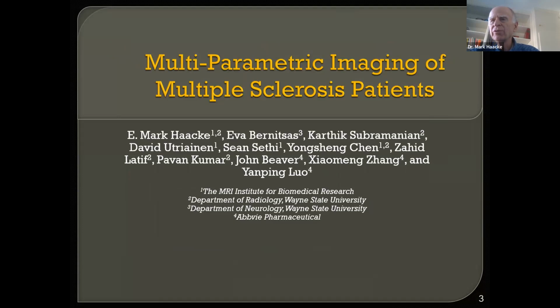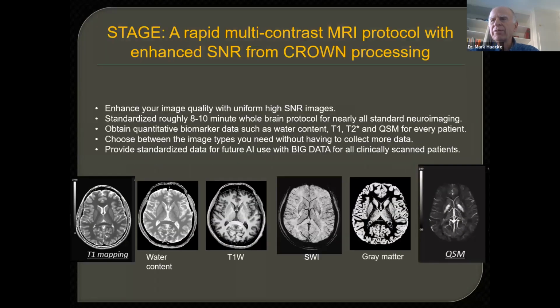This was a number of years ago now. And we ran a method there called STAGE. So I'm just going to give you one slide on STAGE. Usually I give an entire technical talk on this, but we will condense this to a single slide. STAGE is a very rapid imaging technology. It's a method that we developed that can image the whole brain in times ranging from 4 to 6 minutes. And if we add some conventional imaging on top of that, something called FLAIR, which you know, and DWI, then the total scan time to image the brain is 8 to 10 minutes.